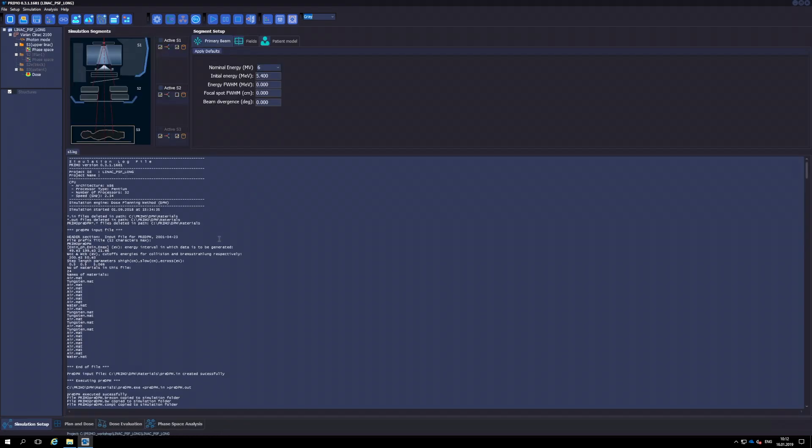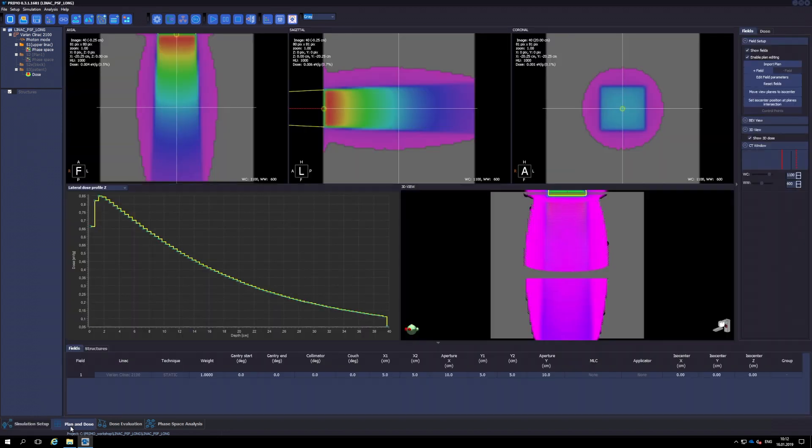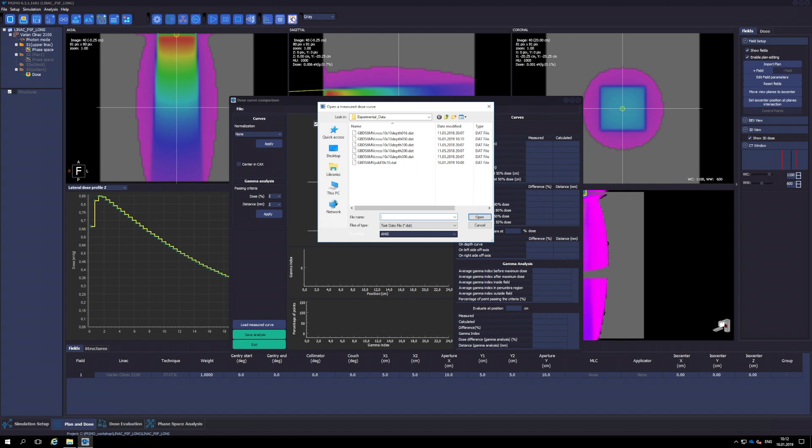To compare with experimental data, we click the Plan and Dose tab, and then the corresponding button. In the browser, we choose the ASCII file containing the relevant profile, in this case a depth-dose distribution.